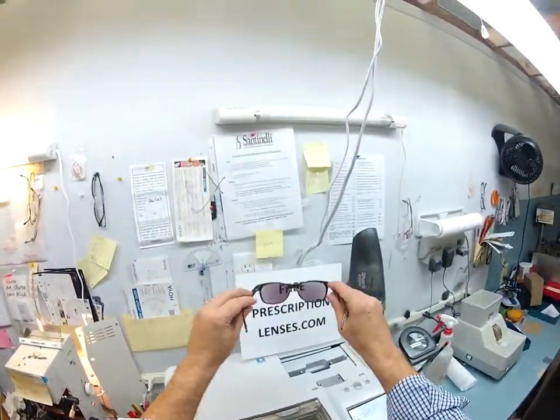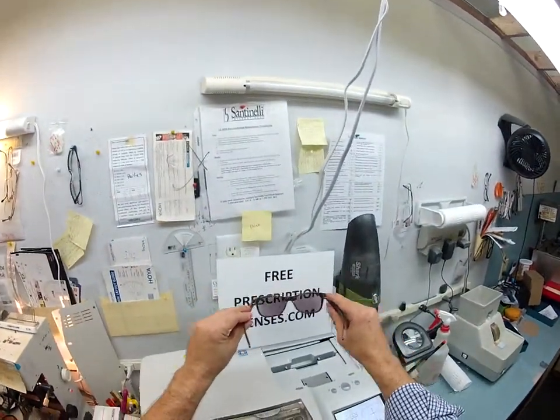So here are your lenses. That's them as they darken. Don't worry, they're going to continue to darken every day for the first couple weeks.